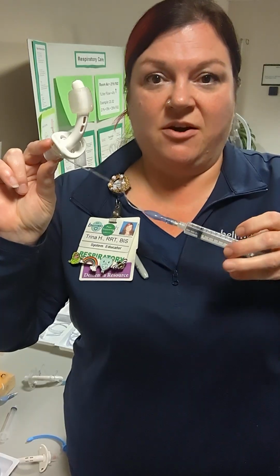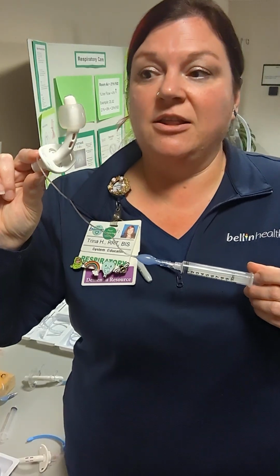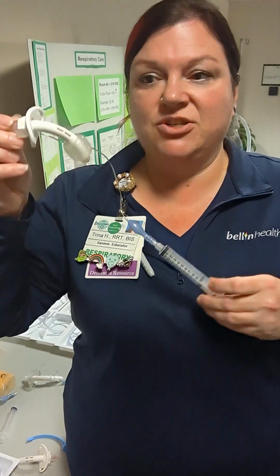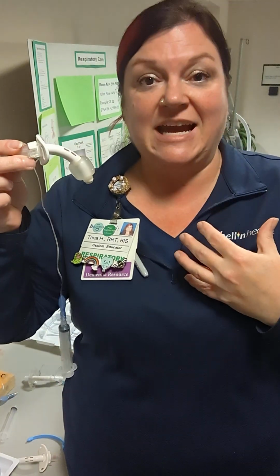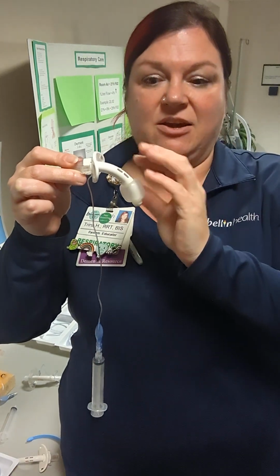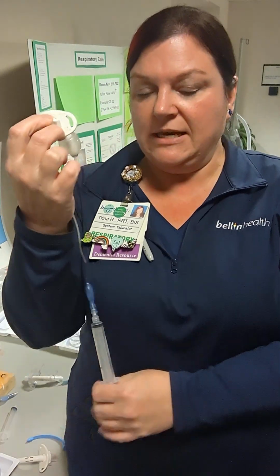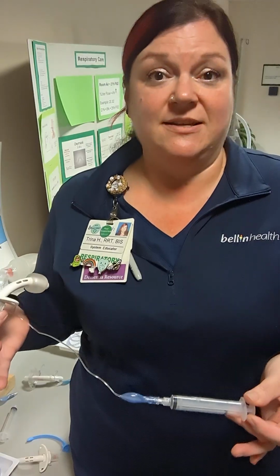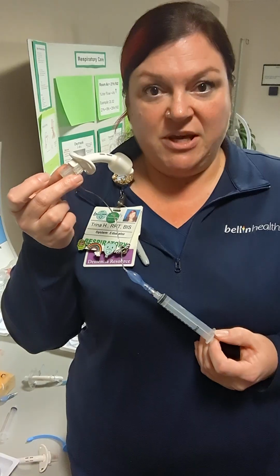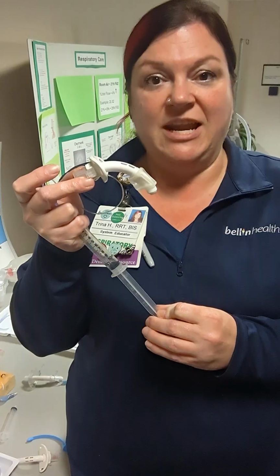Our patients might be cuff up when they're on a breathing machine, so a BiPAP or a ventilator. They might also be cuff up if they're at risk for aspiration, so where they're having tons of secretions that they're actively aspirating. This cuff will protect the airway, so any of that that has come down will be trapped here, and it's not going to sink further into their lungs. It's not perfect, but it's a reason why they might do that. When a patient comes out of surgery and they're on a ventilator, they're going to be cuff up. When we get them off the ventilator, they're going to be cuff down.